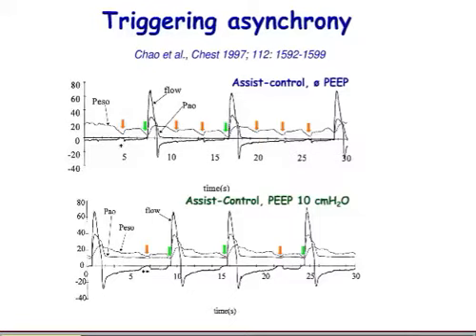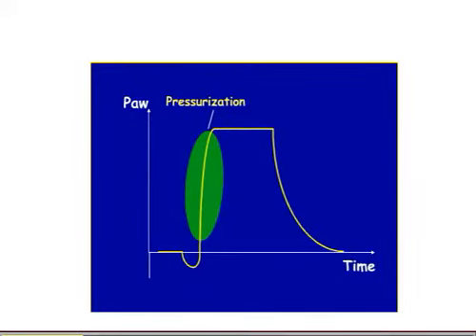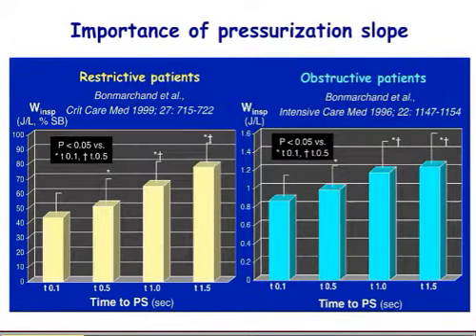As we will see, there's another course of action which is looking at the level of pressure support, and I'll come to that in a little while. Now, the pressurization slope is a fairly straightforward issue, at least apparently.